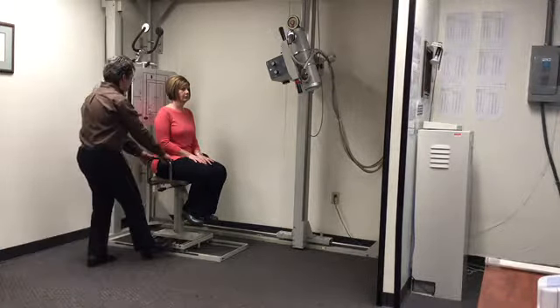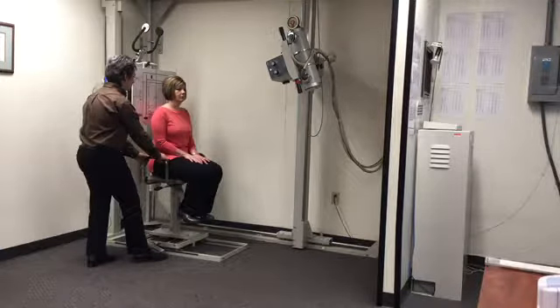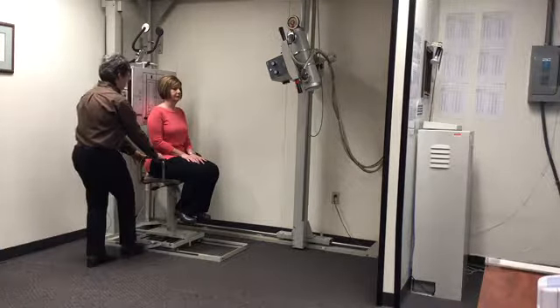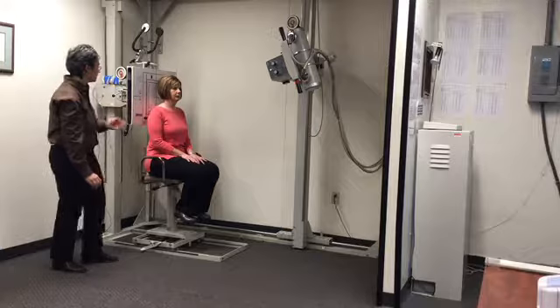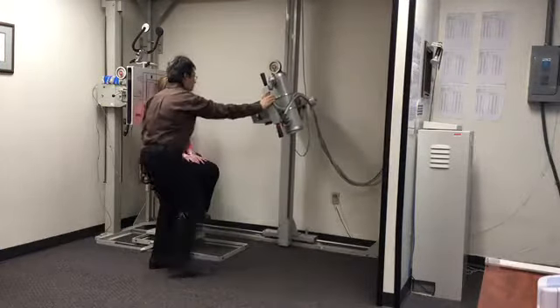And I'm going to let her know I'm going to gently back her up towards the bucky, and I want her to tell me when her shoulders or her upper back touch. Touching. So at this point, don't expect the patient's occiput to touch the bucky. For most patients, it won't, and that's okay. So bucky to patient, patient to bucky, tube to bucky and patient.